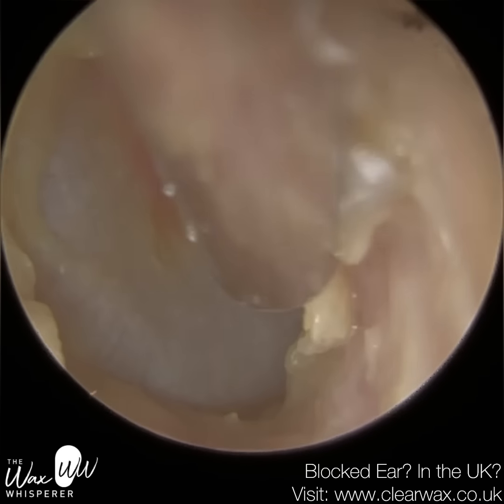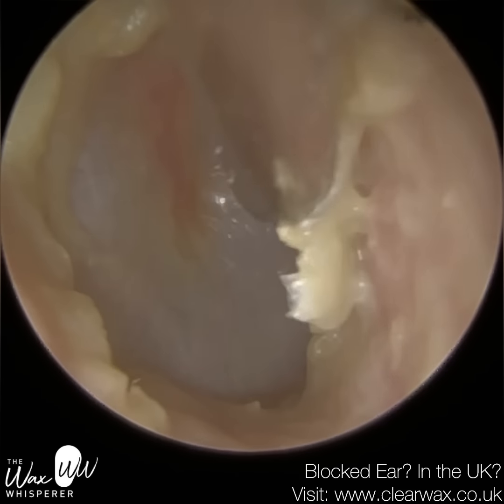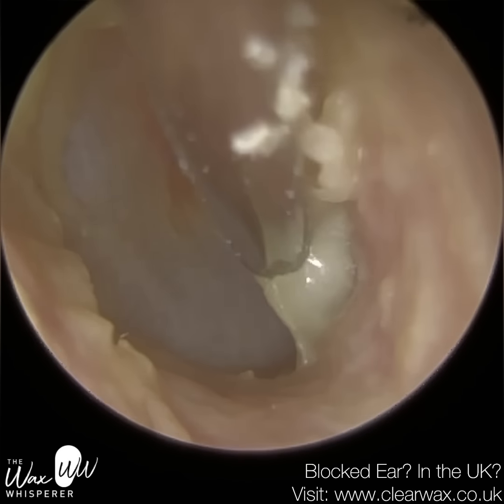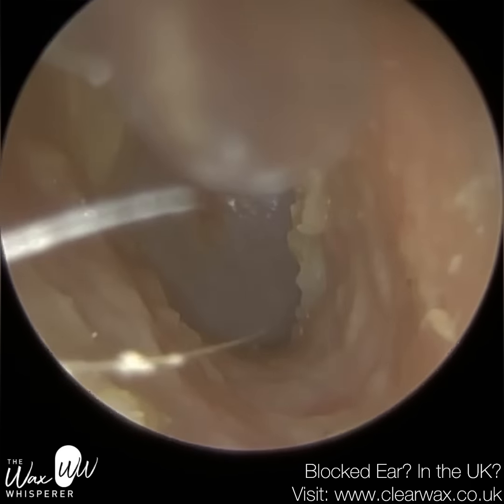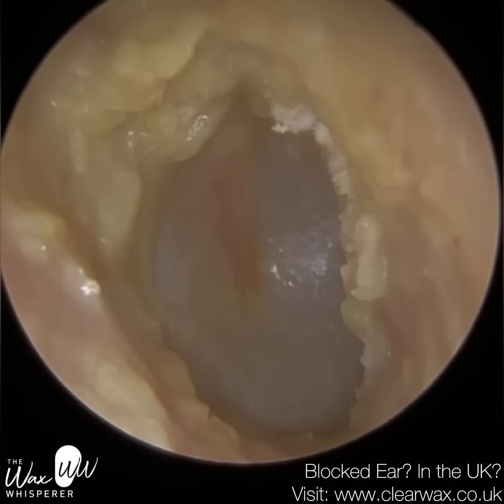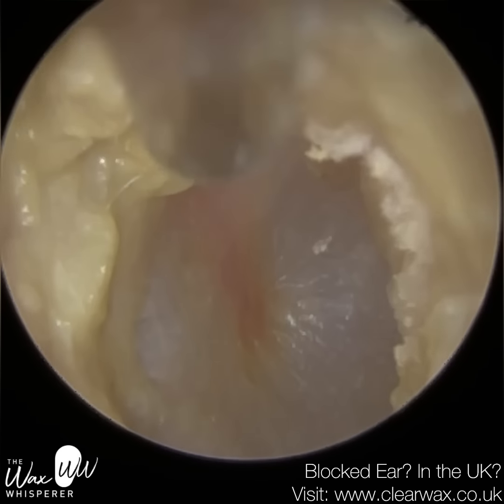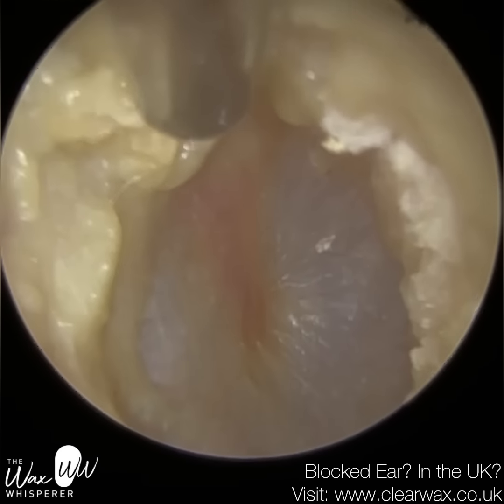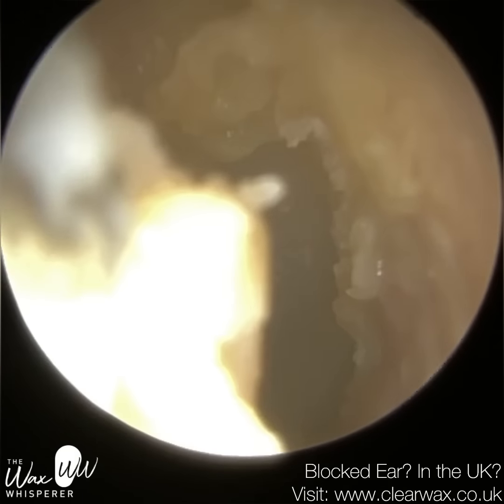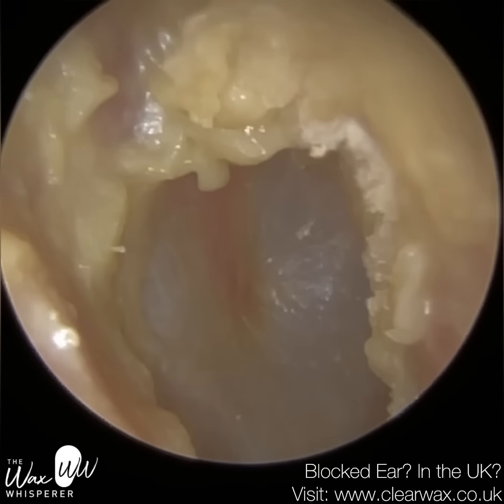So you can see the black fungal spores here, in addition to the white woolly strands. So we know, because this patient's got fungal spores and these white woolly cotton wool look-alike strands, that they've got definitely a strain of fungal infection called Aspergillus. Now you can get Aspergillus niger and flavus, which grow in the ear. They may also have some candida. So candida is a bit more difficult to diagnose, but typically with candida, it's a bit more thick and creamy, just more like the left side. And also there is some thick, creamy discharge here. So they may have multiple strains here.